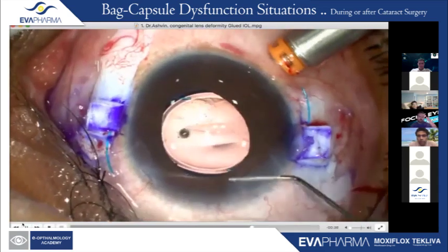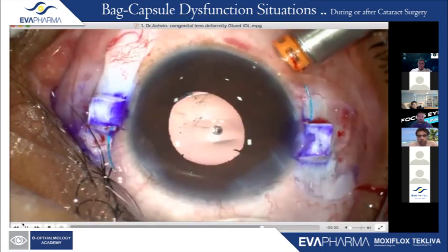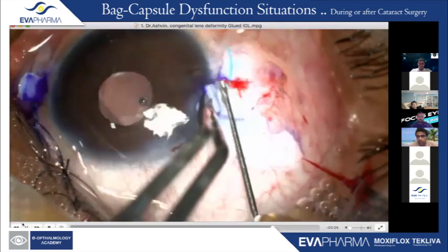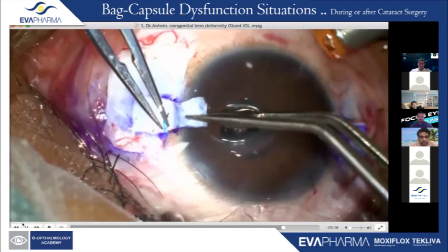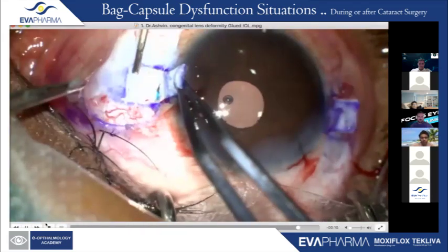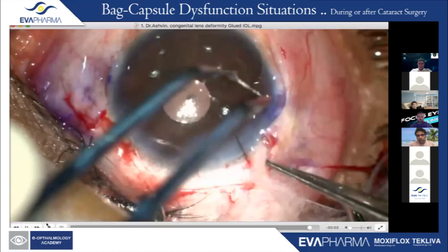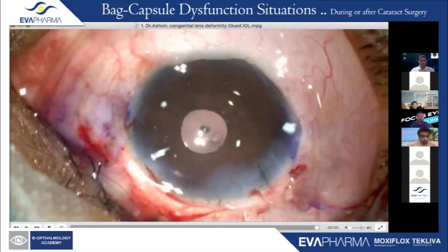Even though you probably have to do infusion, vitrectomy, and so many things, honestly speaking, today, if you ask me, gluing is easier than a really tough cataract today. Honestly, this is how I feel about it, because once you get the hang of doing it, it's pretty easy. Especially in an aphakic case. I know that the complexities which Brian was talking about are very different, which is where, again, we've all reached that stage at least. But initially, I agree, use only the aphakic patients, what Priya had showed, to learn this technique. That's how I do it in these pediatric cases.